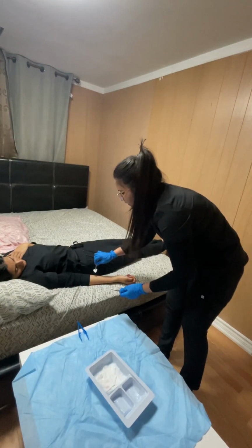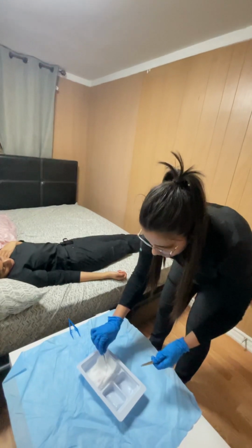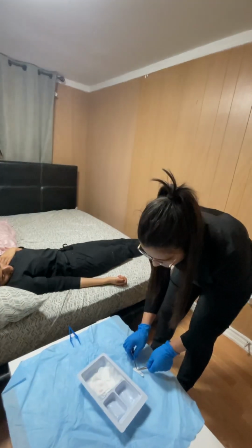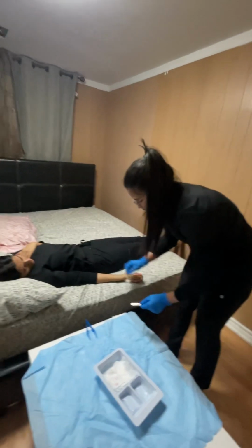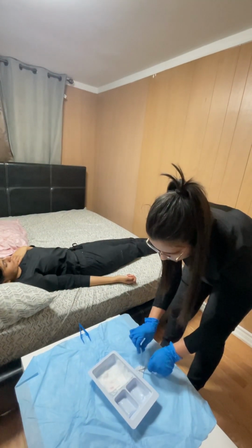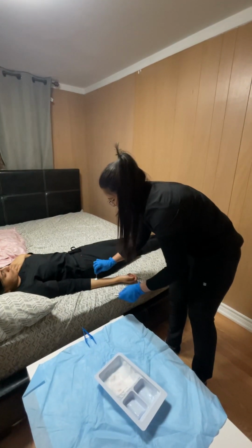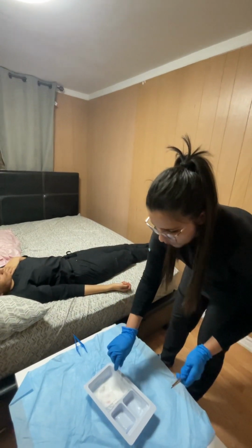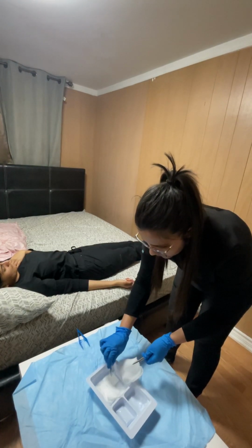So we'll pat it dry from head to toe to the farthest position. Patting dry the area closest to me, discarding it off. Making another dumpling for patting the area along the midline and discarding it off. So after cleaning and patting it dry, we are going to cover the wound with a gauze piece.